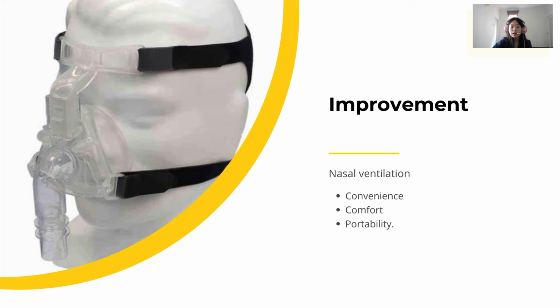In a study by Simonds and Elliott, a nasal positive pressure ventilator was used for a prolonged period of time on 180 adults. This method resulted in an improvement of oxygenation and alveolar ventilation. And in a small subset of patients who switched from negative pressure to nasal ventilation, the blood gas tensions also improved.